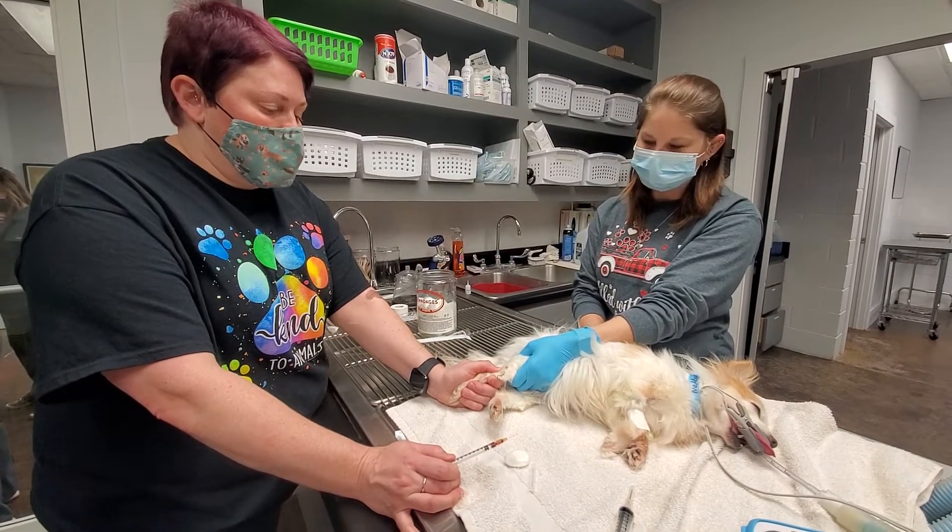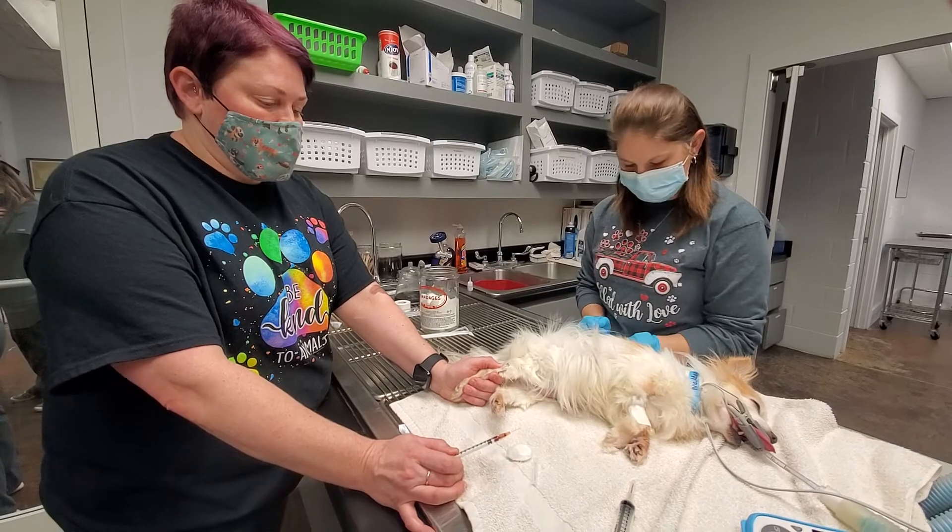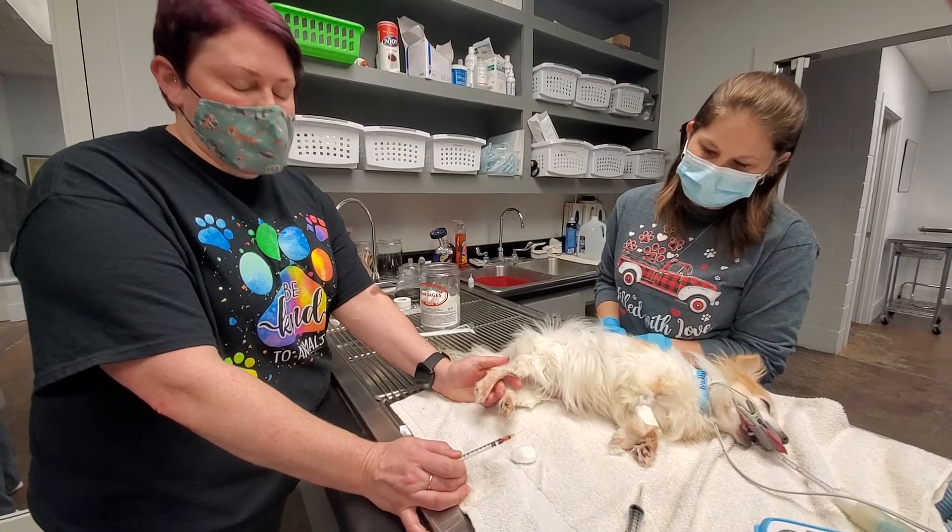I'm going to have my restrainer let go. She's good.